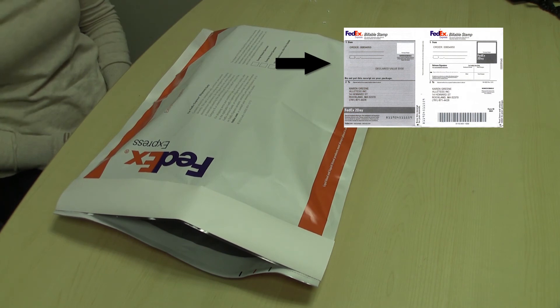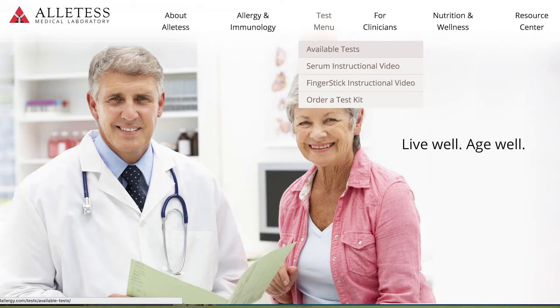For a complete list of available allergens, please visit the test menu tab at the top of the screen and select all available tests. Your sample is now ready to be shipped and tested. Thank you for ordering your Alletess test kit.